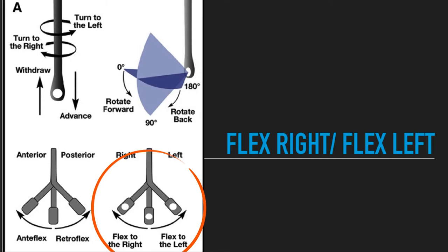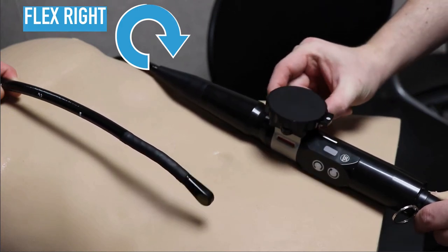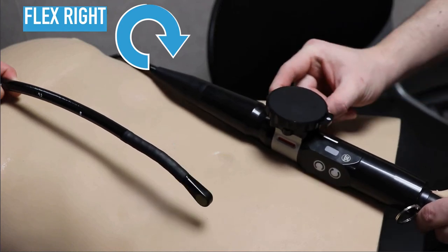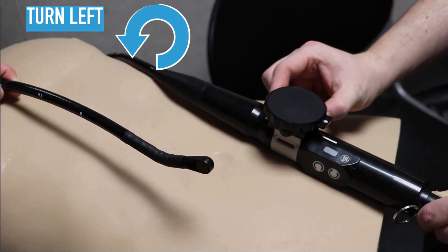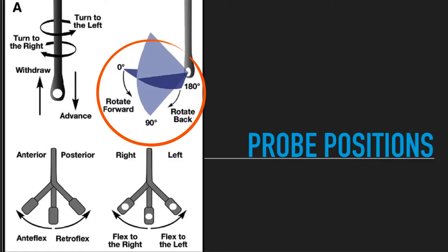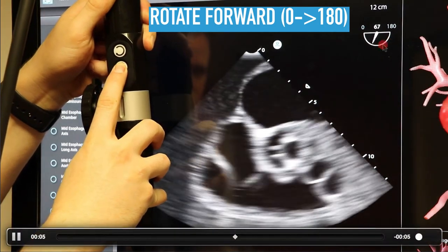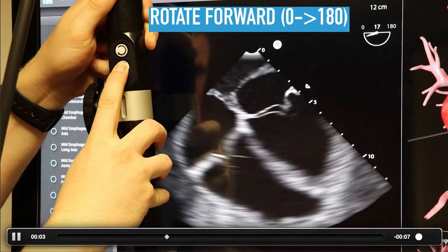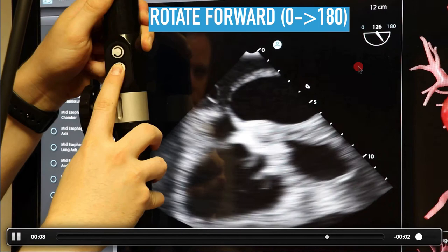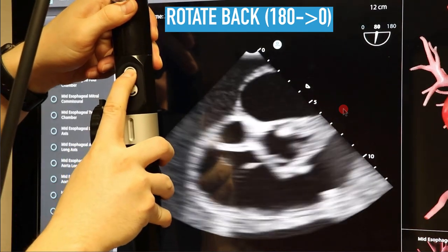Flexing to the right and left is the next cardinal movement — we'll use this a little less. This uses the bottom knob: rotating clockwise moves the probe to the right, counterclockwise moves it to the left. This will probably be our most underutilized movement. Finally, the omniplane rotates the crystals forward or backward. You can see the omniplane angle displayed in the top right corner of all TEE machines — it advances going up in number and rotates the crystals within the transducer. Hitting the other button returns you back towards zero.